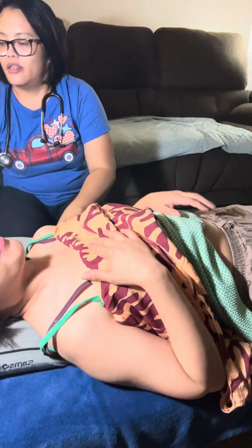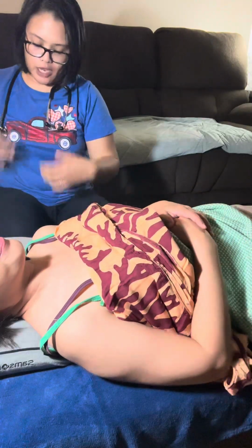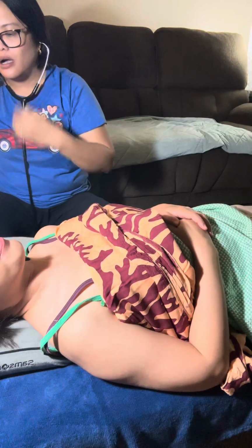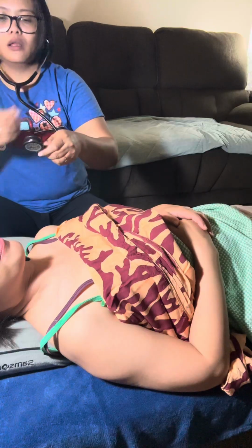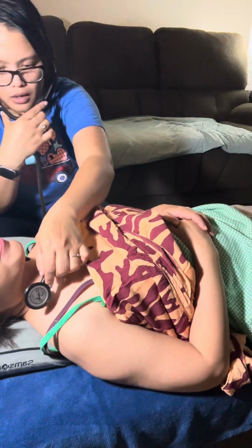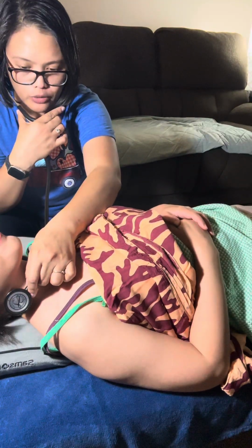I will do the auscultation for all those sites, but I'm gonna start first with the carotid area. Okay, remain still, friends. I want you to hold your breath.